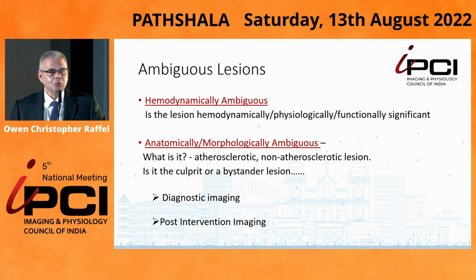The second one, which I suppose is more useful in this context, is it anatomically or morphologically ambiguous? What is the lesion? Is it atherosclerotic? Is it non-atherosclerotic? Is it the culprit? Is it a bystander lesion? And we could do this in the context of diagnostic imaging or post-intervention imaging.